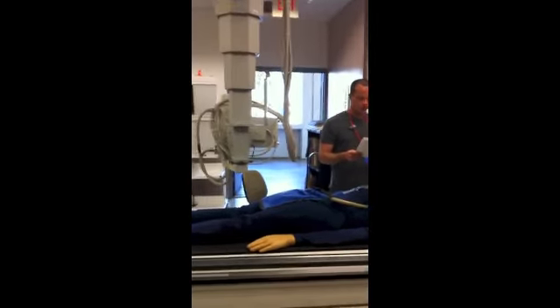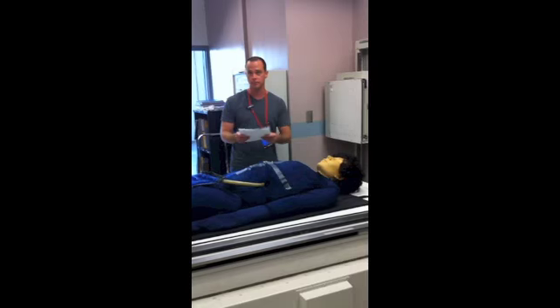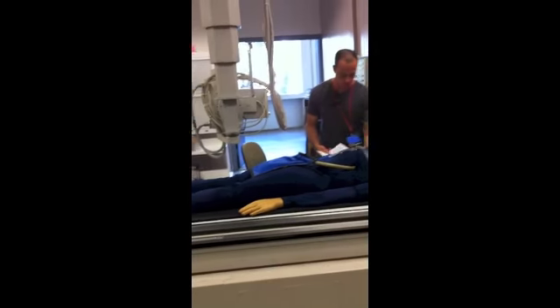Now it's time to move on to the knee. First, we'll be doing the AP knee. I need to set up for that.